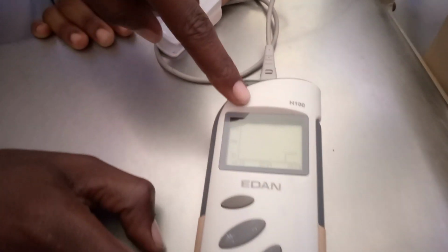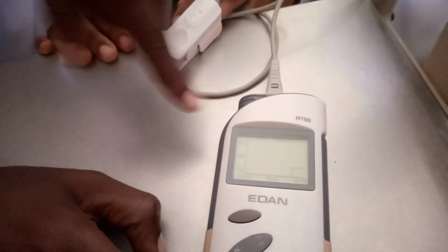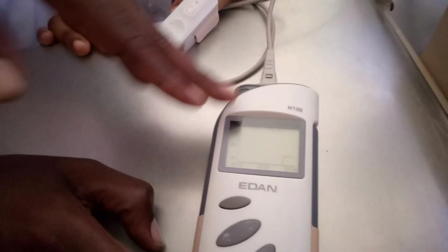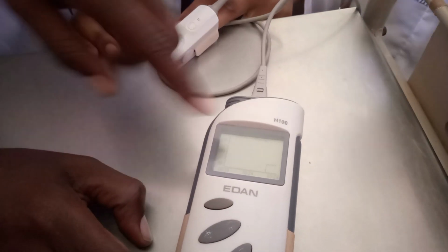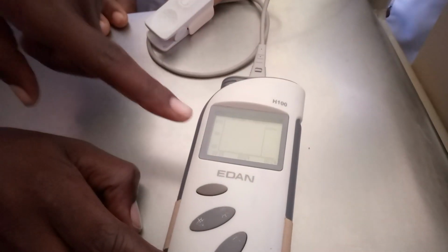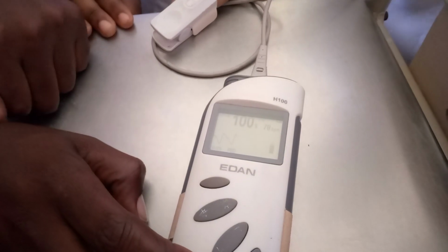Another part is the pulse. The PR trend means pulse trends. It will show you the trends and what time the pulse was taken, or what time maybe it was at 90. It will show you that the pulse was 90 somewhere there. So this is the trend. This one shows you the trends for PR, which is pulse, as well as SpO2 trends. As you can see, it's about to pick and show the trends. This is how you get the previous readings, and the current ones are there.